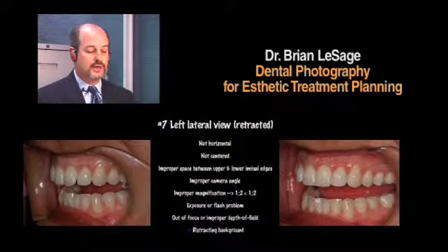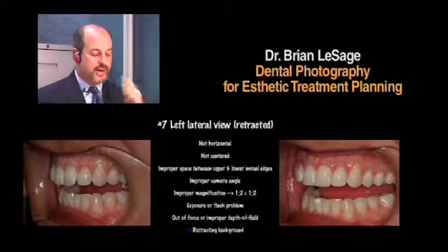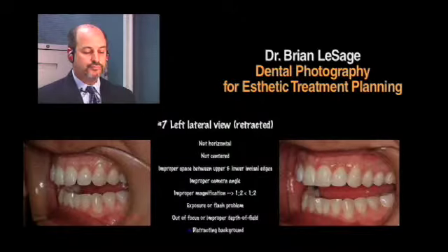So on the view on the left, I put a distracting background here. Well, you can see her fingernails. She's holding the retractors, so that we'd rather not see.